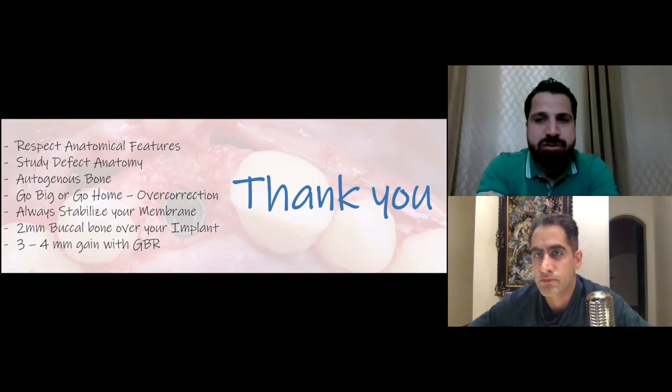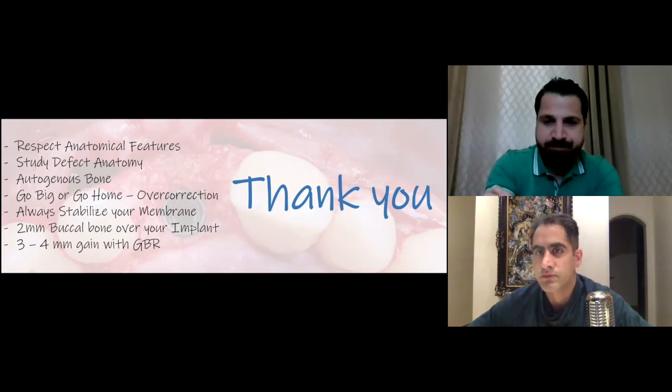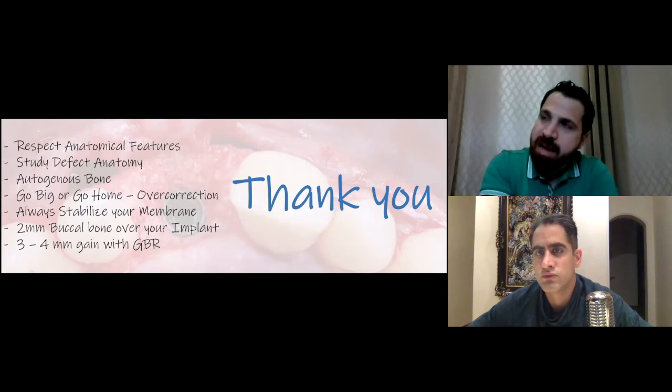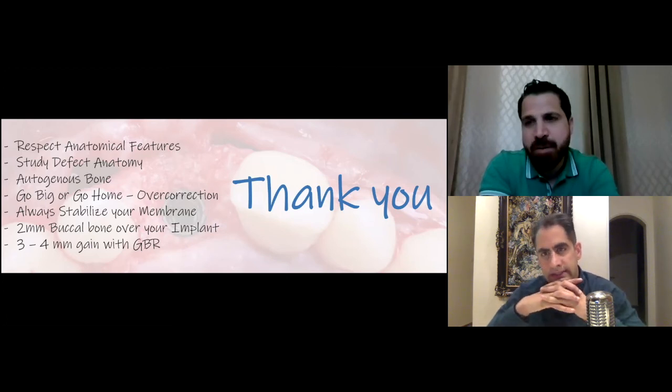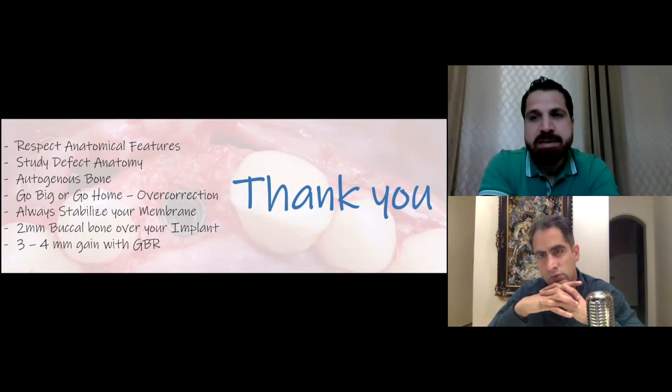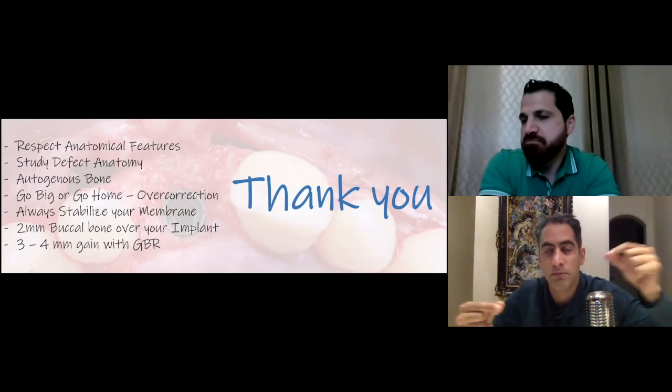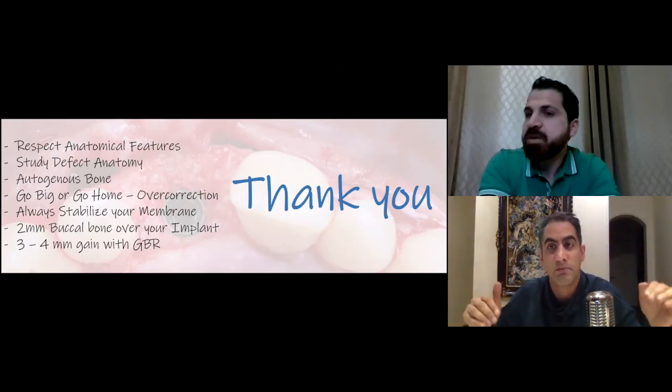Unfortunately, I didn't use these plates. It's not really on the market in Kuwait, but I would love to use it. The only thing that I would worry about is, is it going to affect my flap? Would I have an exposure of these plates? This is the important thing. So if I'm going with these plates, why shouldn't I do titanium mesh? Yeah, because titanium mesh is almost the same. Plates are very narrow, so maybe the risk of exposure is going to be much less.